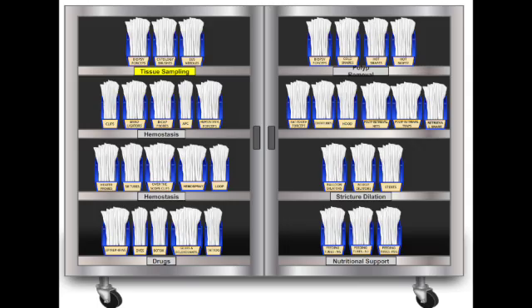Okay, makes sense. Now, getting things out, retrieval tools, the net. Retrieval net, exactly what it sounds like.